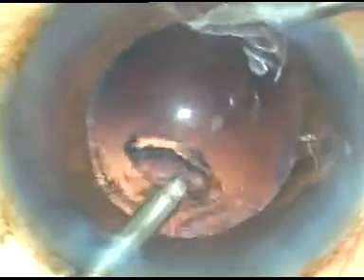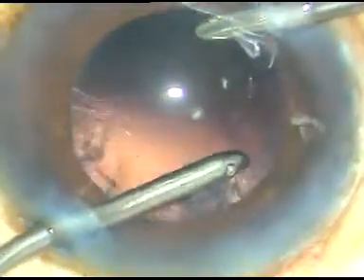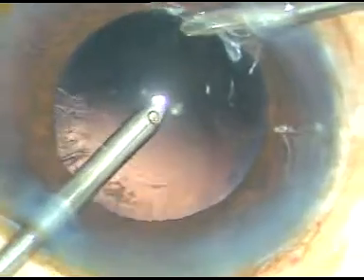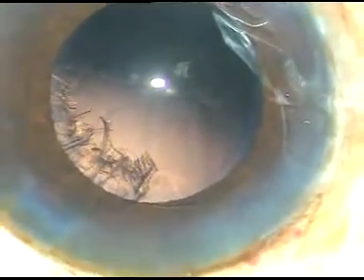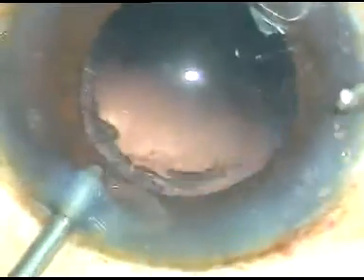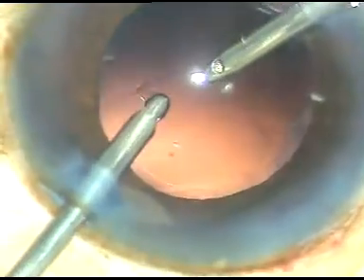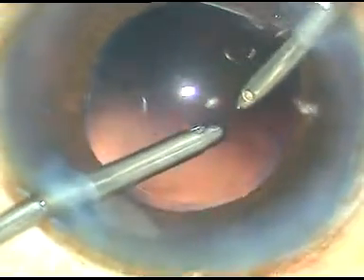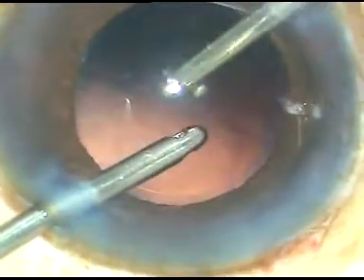Here I can see the cortical matter and I am removing it quite efficiently with bimanual IA. I was using Simcoe cannula for a very long time and I have started using this bimanual IA very recently.